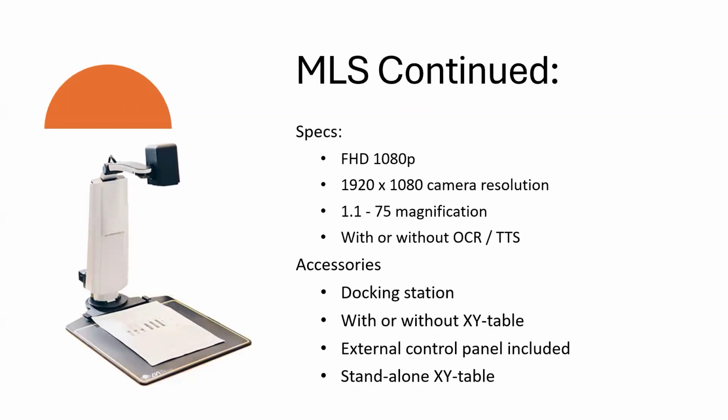We have a few other things that we want to talk about with the MLS that maybe you might not know. The particular slide that popped up now says MLS continued. We're showing the MLS in a docking station, and this is a plate docking station. So it kind of turns it into the same format as it would be if it were a zip. It's that same type of plate that would be at the bottom of that zip, and that MLS is put in there. You can tell that there's an actual structure that holds it, which makes the camera very, very tight. So there's no wobbling to it or anything like that.